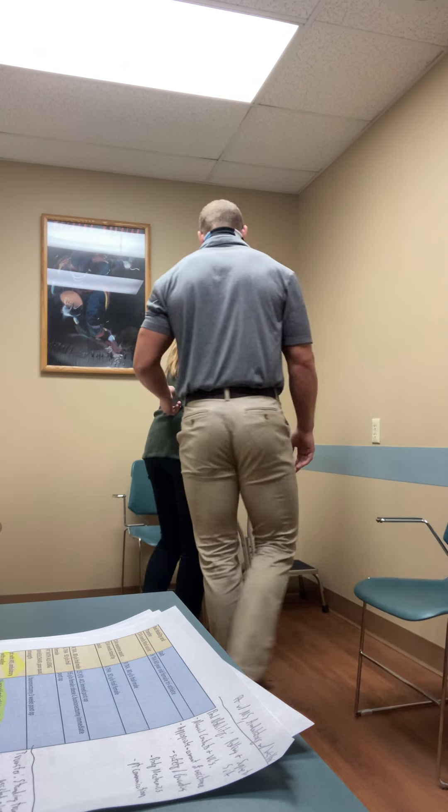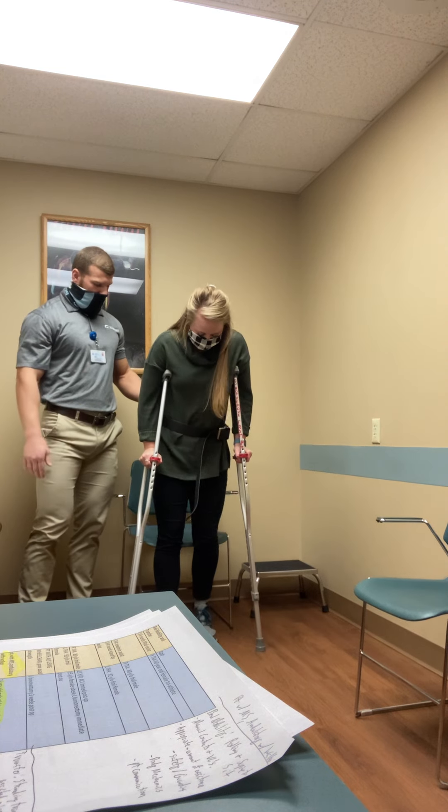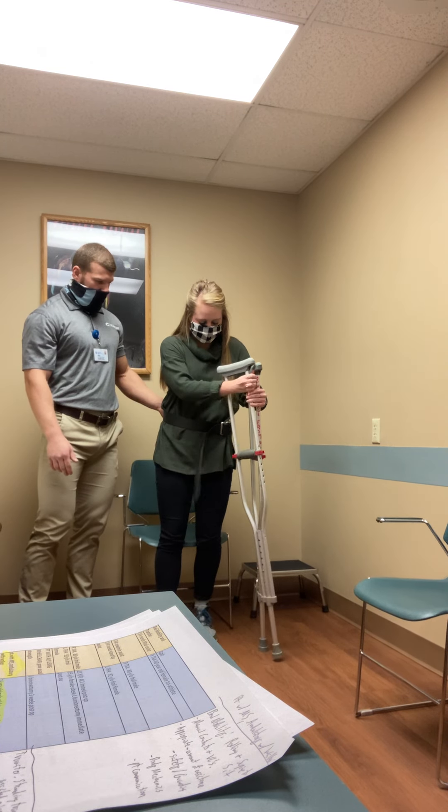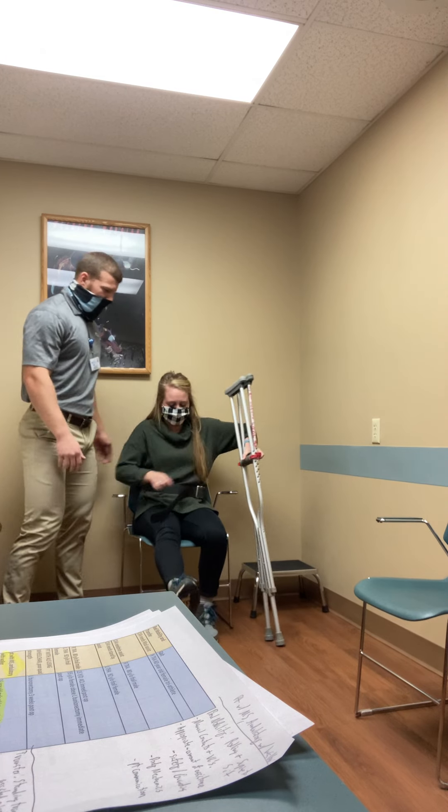Let's go ahead and have a seat. Same thing — crutches in the left hand as you back up to the chair. Very nice.